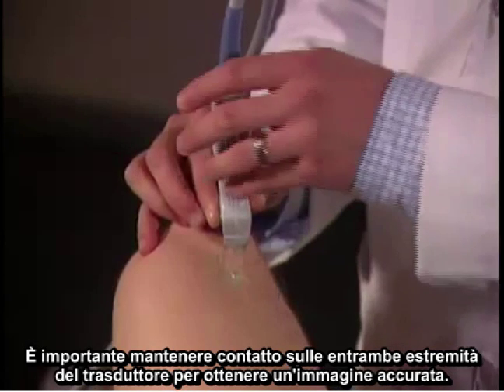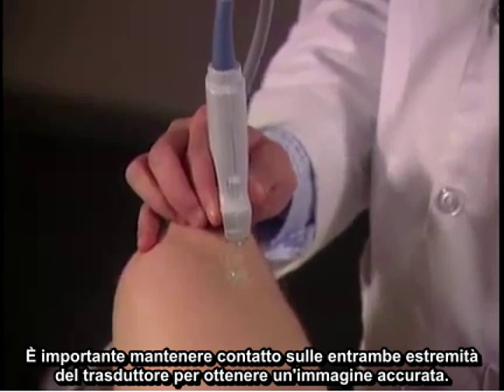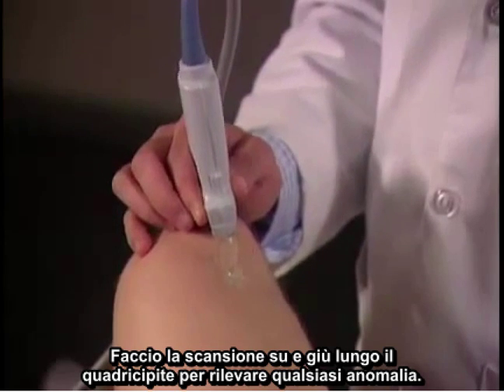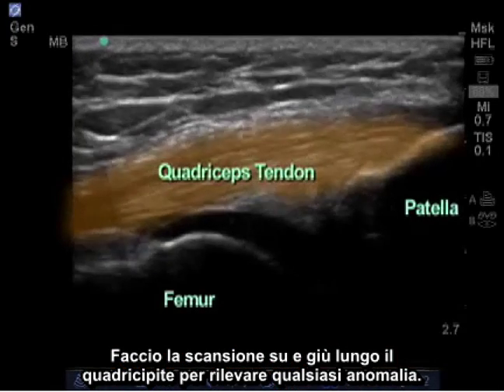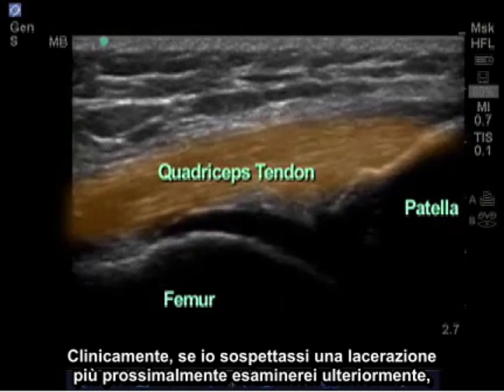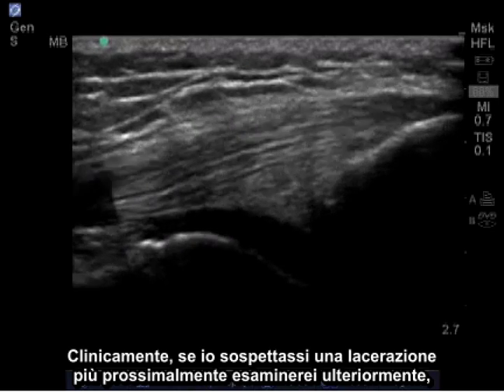It's important to maintain contact on both ends of the transducer to get an accurate image. I'm going to scan up and down the quadricep to detect any abnormality. Clinically, if I suspected a tear more proximally, I would examine further, but for most purposes this is sufficient.